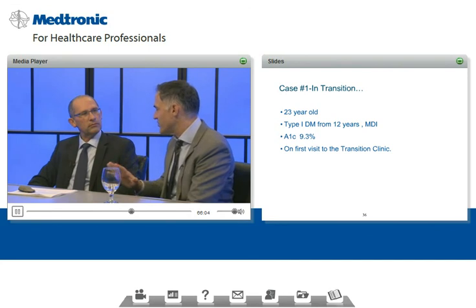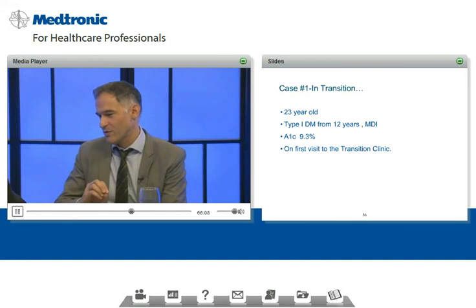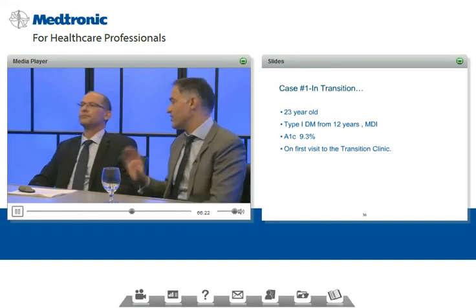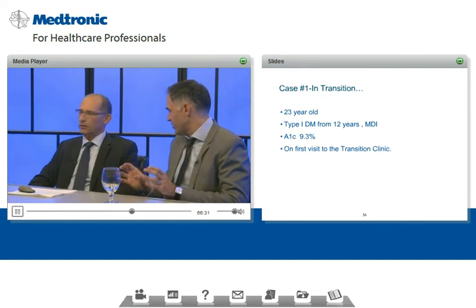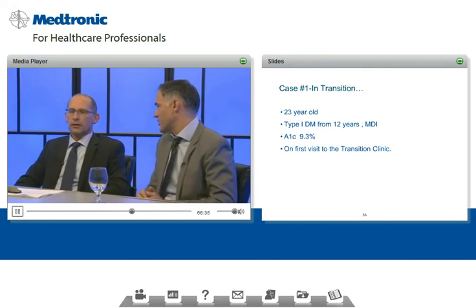Make sure that there's some day where you can evaluate your basal, that you've delayed lunch a bit or you've not eaten lunch, so that when we next meet, we can be sure that that decision was the right one. I think that's a good approach too, because we can't always put people through basal assessments, bolus assessments. We need to make some changes, and you've shown us a nice way of doing it. We can always remind them that this solution we think was the best one, but be on the lookout for lows that are happening when you're not eating, because it could have been too much basal as well.